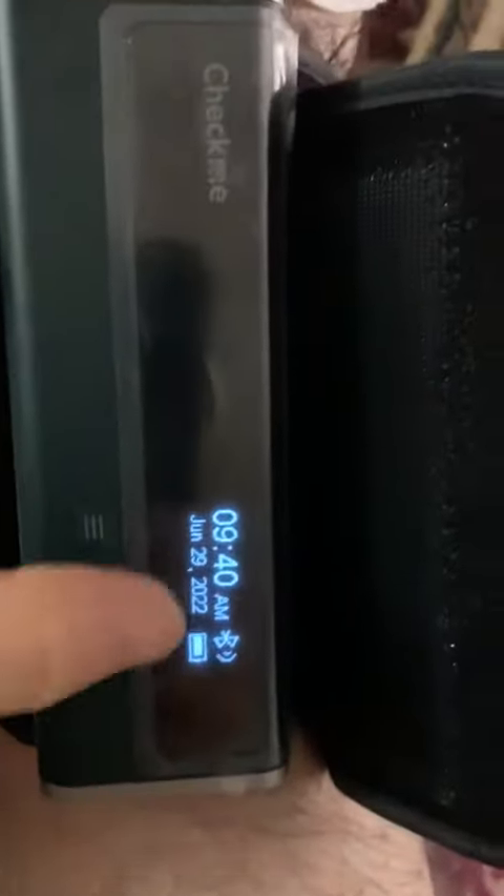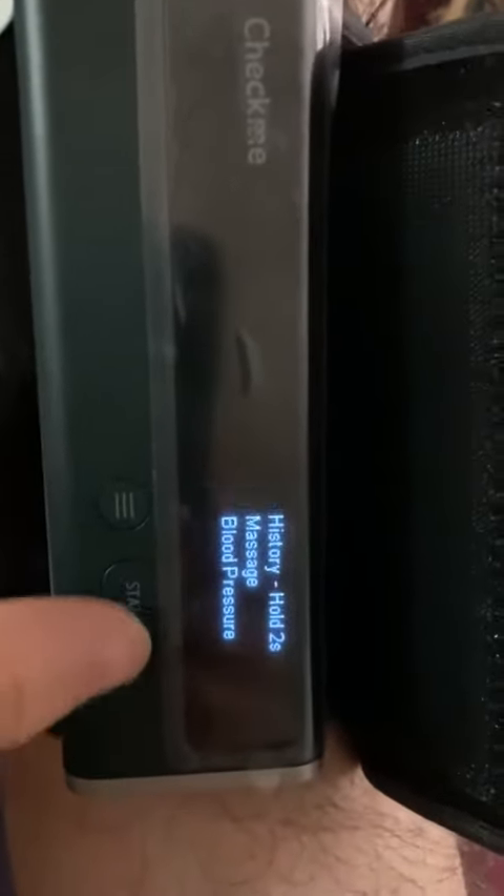Put it on. Just make sure there's a couple of centimeters — about half an inch — to the side, and we press the power button. It turns on after a couple of seconds. You press start again.